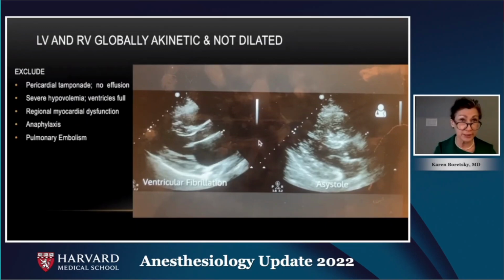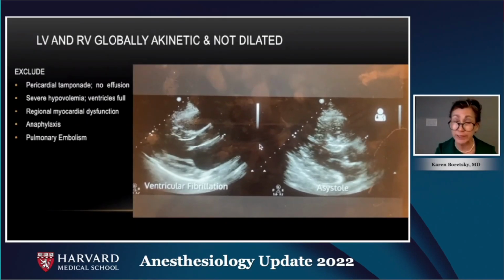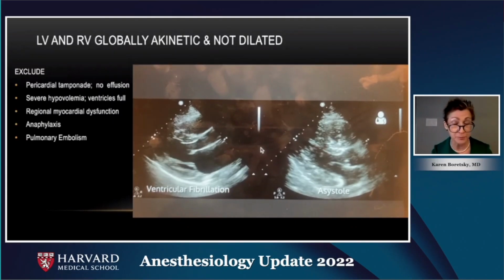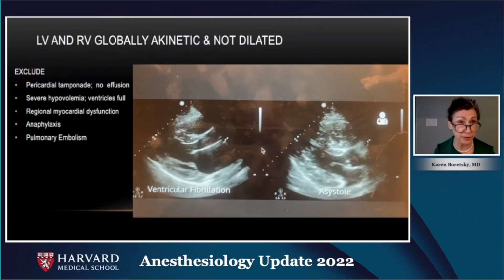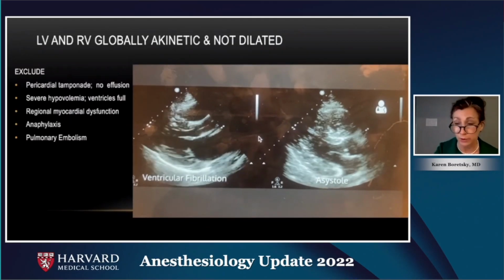So it's not that in this case we got the diagnosis right away, but we eliminated a lot of the immediately reversible causes of cardiac arrest. And it turns out the patient had hyperkalemia from his renal disease and from the succinylcholine.